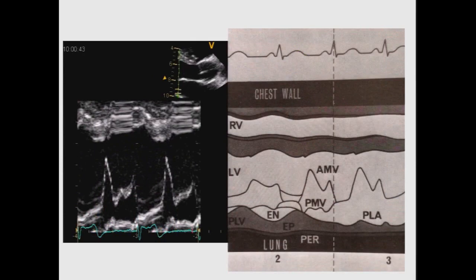Here's, again, a blow-up of the M-mode cursor now through the mitral valve. And in the interest of time, I won't reiterate what Dr. Kronzen showed you about the motion of the mitral valve.